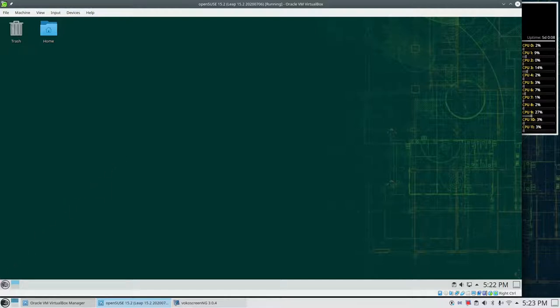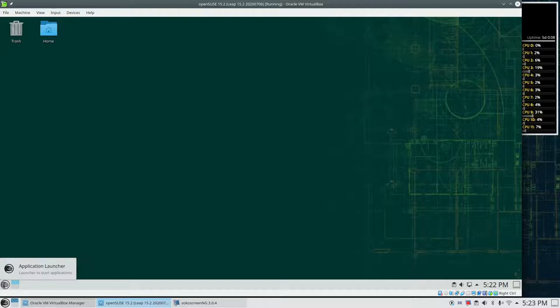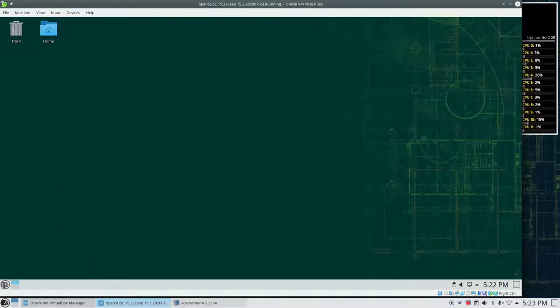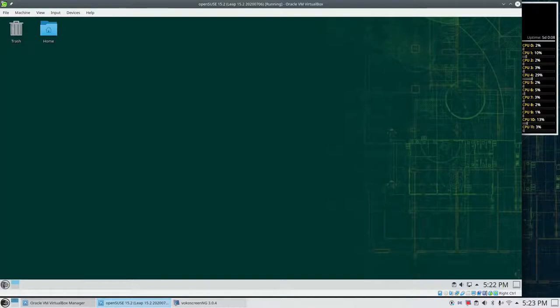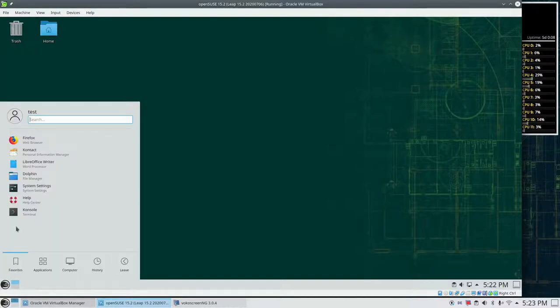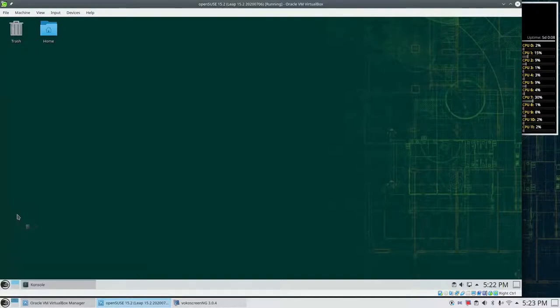So now we want to install Orthanc. Orthanc is a PACS server, a Picture Archiving and Communication System which is used to handle medical images.